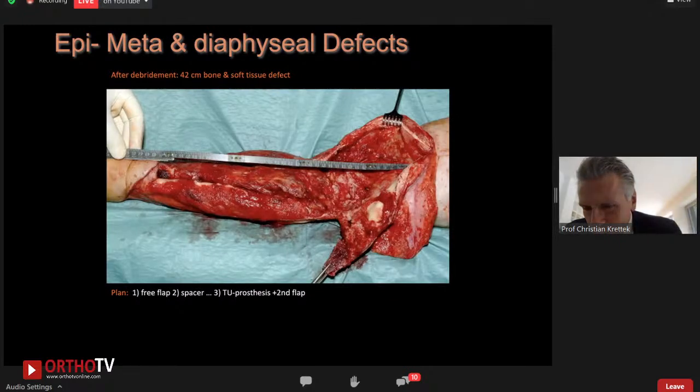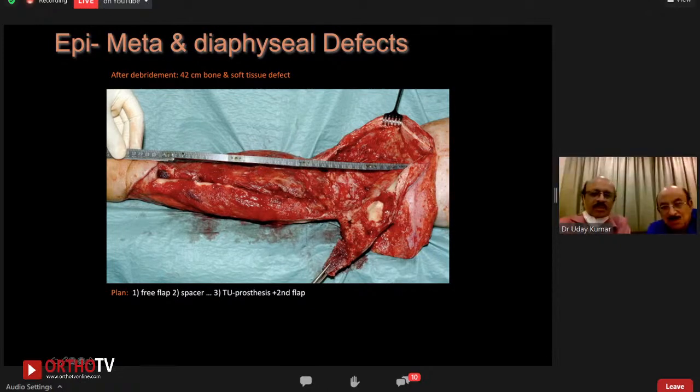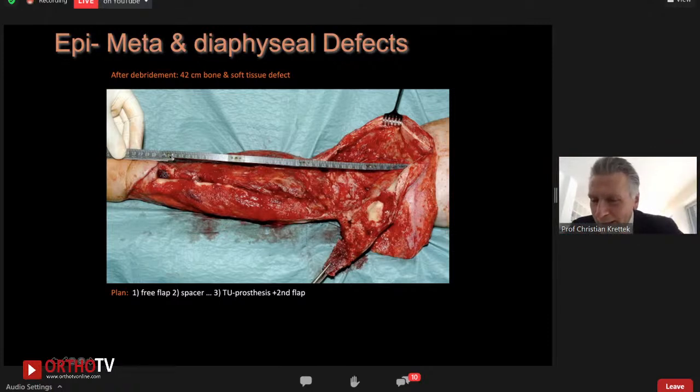Oh my. We had a 42 centimeter defect. So you see here, that's the remaining tibia. The posterior part is a bit longer. This is tendon. And we see here the patella. So it looks beautiful. We have a tuberosity. And here ends the prosthesis. So this is 42 centimeters. Femur prosthesis.